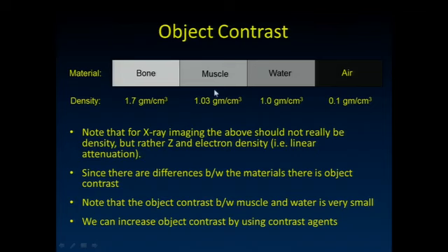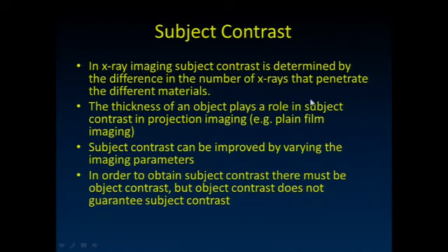Notice there's quite a big difference between bone and muscle, but muscle and water are very similar, and they're quite different from air. So there's really good object contrast here. So what about subject contrast?